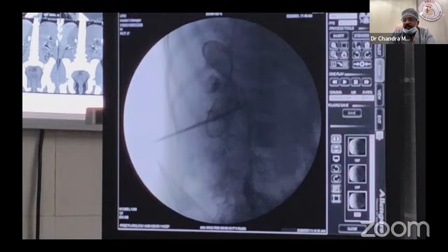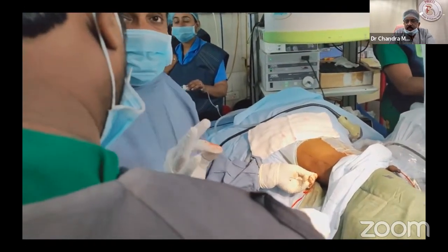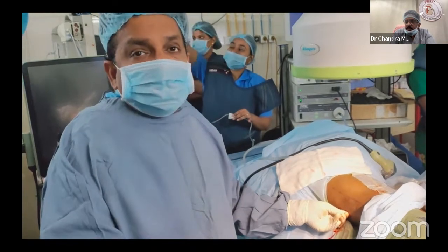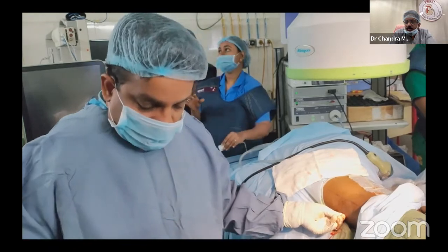So you should rotate front and side to side slowly, watching the C-arm. This is the only place where you require a little more C-arm in supine PCNL, because it will be free in the anterior aspect without any resistance. Observe this. The guide wire from any common company will do the job. What it does is perforate the rectus sheath, quadratus lumborum, any muscle which comes there. It makes a hole so that further dilatations are easy.